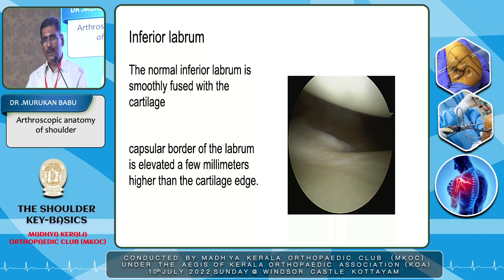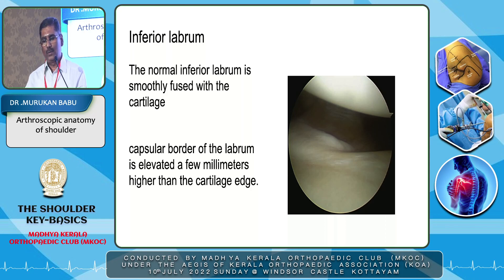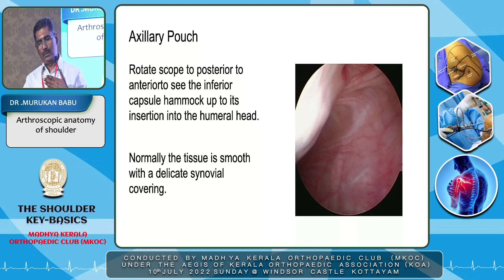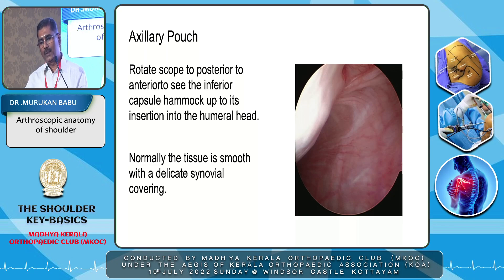The first thing in the third position is the inferior labrum — carefully look at it. The normal inferior labrum is mostly fused with the cartilage; the capsular border of the labrum is slightly elevated, a few millimeters higher than the cartilage edge. The next thing in this position is the axillary pouch — you rotate the scope anteriorly and posteriorly to see the inferior capsular hammock. You all know that the inferior glenohumeral ligament has anterior and posterior bands. See the axillary pouch — normally the tissue is smooth with a delicate synovial covering.